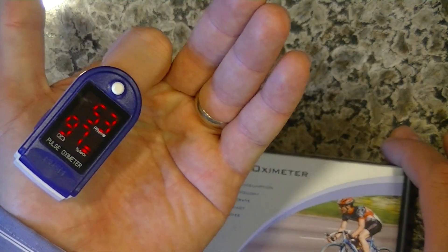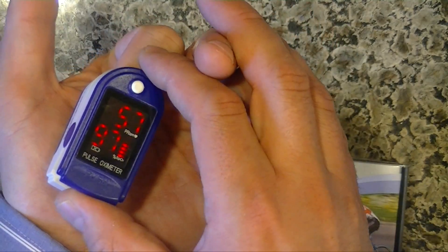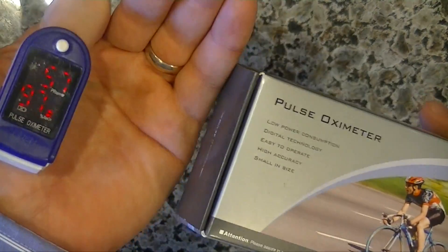As you can see, I've got 97 blood oxygen with a pulse of 57. So I'm doing quite nicely.